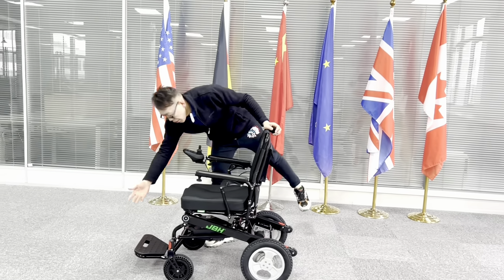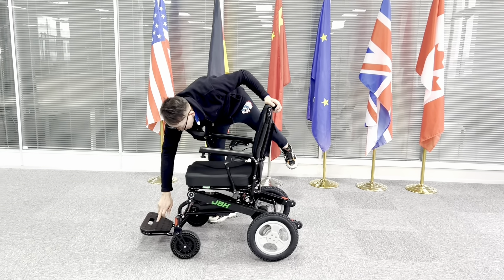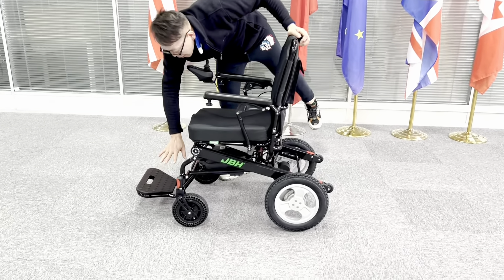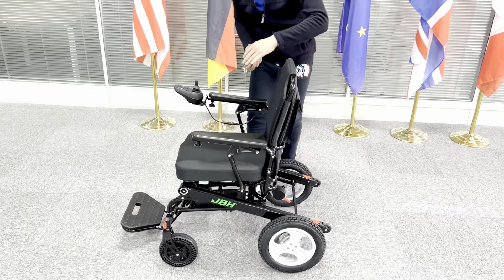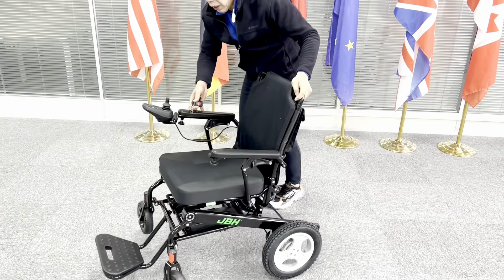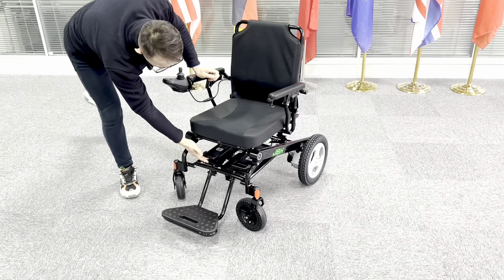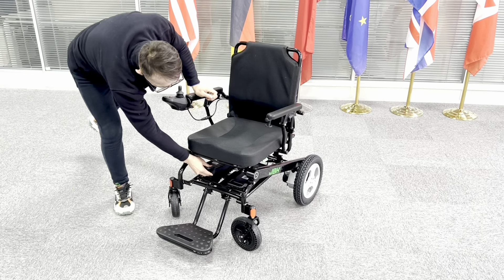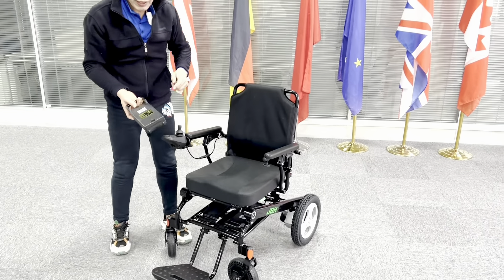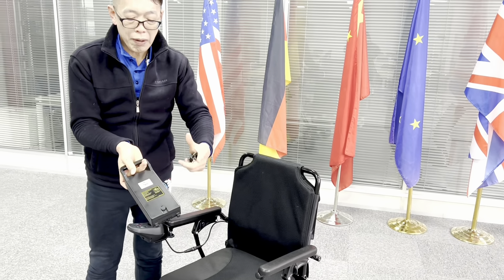We have the footrest with anti-slip spots on the top that you can rest your foot here, no problem at all. Two batteries are designed under the seat and it's really easy to take them out — simply just push it a little bit with your finger. You can take out the battery easily and the size of the battery is really compact.